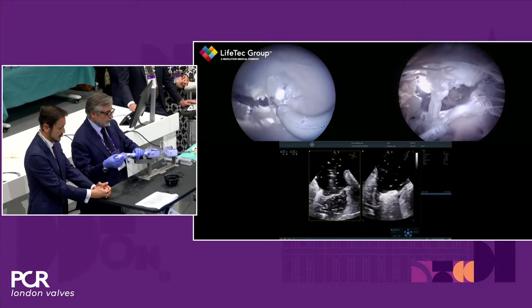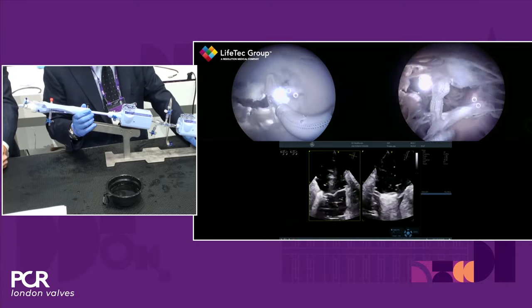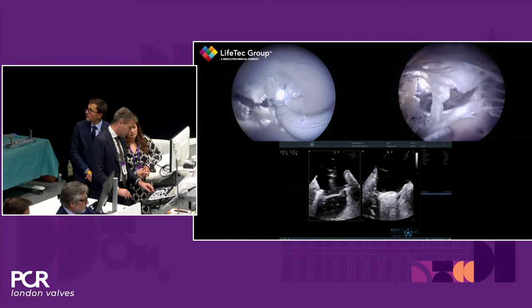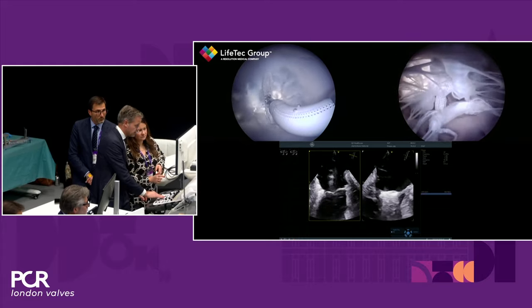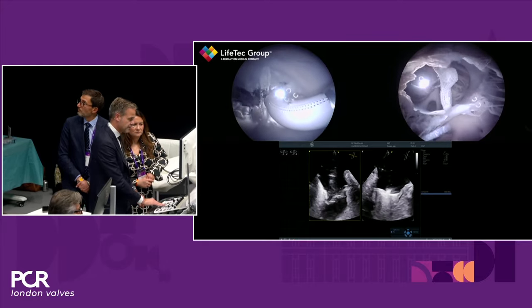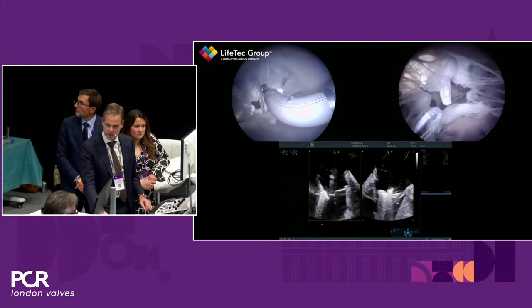Martin, are we coaxial? Coaxial, if we cannot completely see, if we are axial aligned, we would be pointing towards the apex, and it seems like here we're pointing a little bit from medial to lateral on the left side. So again, for the people not knowing it, can we get a cursor? Or can I get a cursor? Good. So we can see, so we have medial and lateral, and we can see a little bit when he moves up and down, it comes from the medial side and dives into laterally. So it doesn't seem to have a straight path towards the apex here, but it might be the deer anatomy that might be causing this.